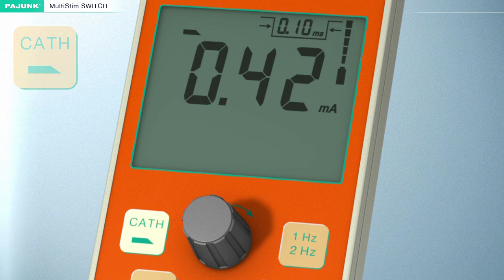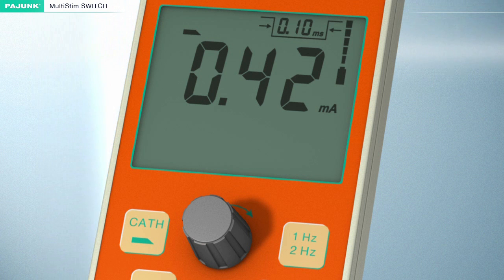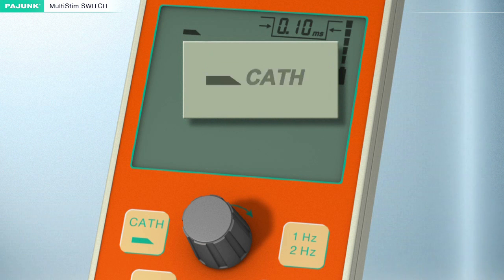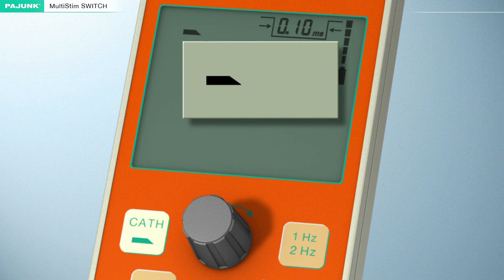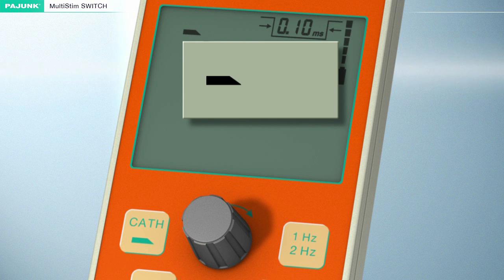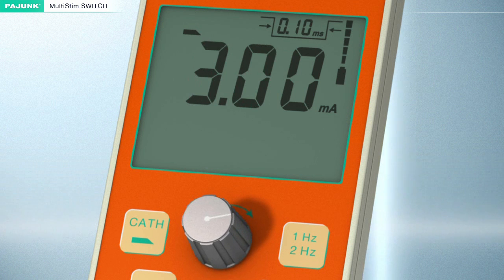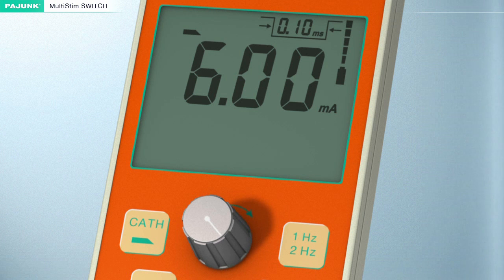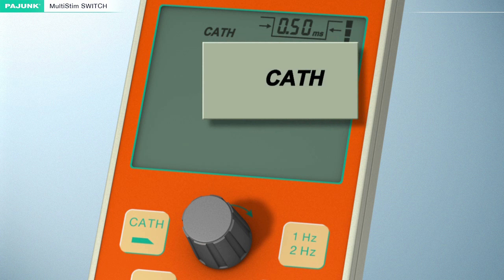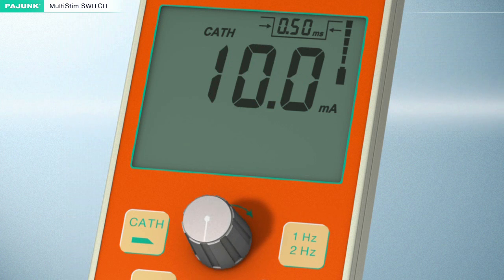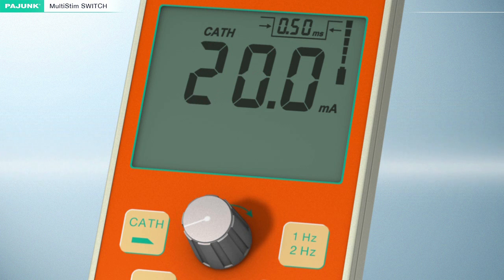Output channel. The Multi-Stim Switch provides two alternative options for stimulation: via a cannula or through a stimulating catheter. This switchover function enables the anaesthetist to toggle between the catheter and the cannula. If stimulation by cannula is activated, a needle symbol will appear on the display and the maximum stimulation current intensity will be 6 milliampere. If stimulation by catheter is activated, the word 'cath' will appear on the display and the maximum stimulation current intensity will be increased to 20 milliampere, corresponding with the specific requirements of epidural stimulation.